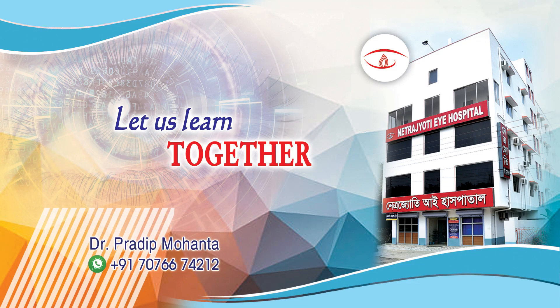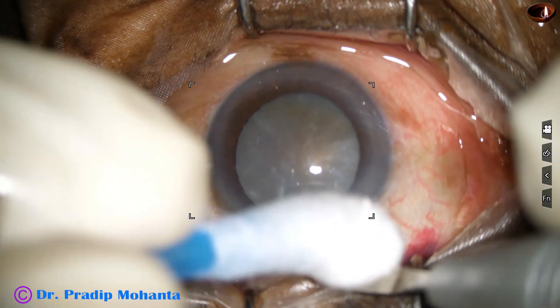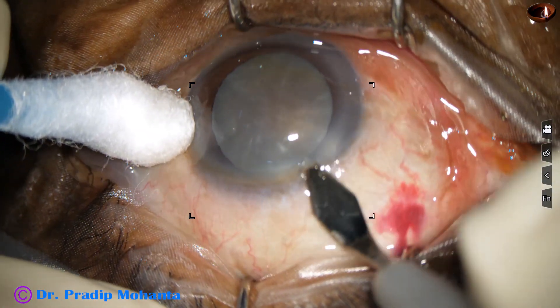Friends, welcome to my workplace at Ranagh Heart, West Bengal, India. This is a white cataract and at this moment we don't know how hard the nucleus is. Let us observe management of this cataract.